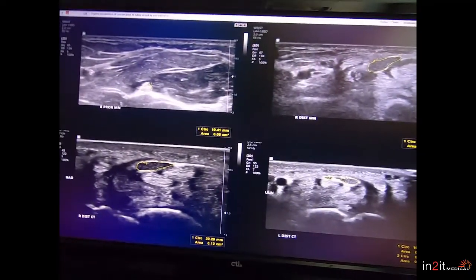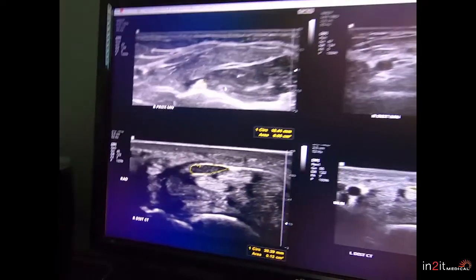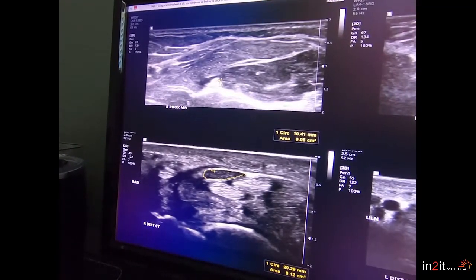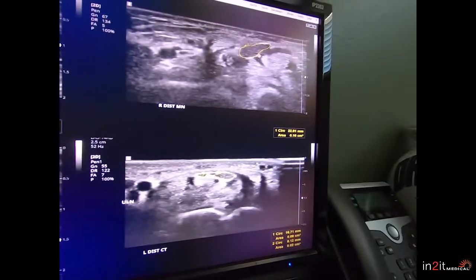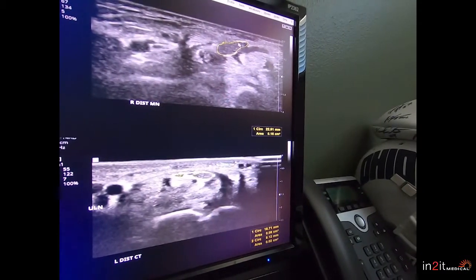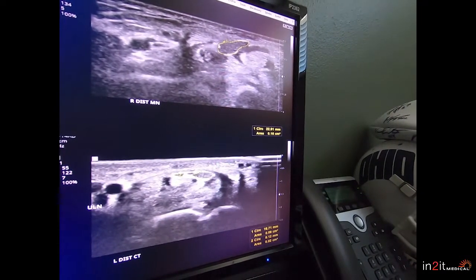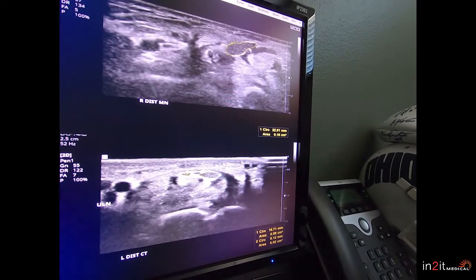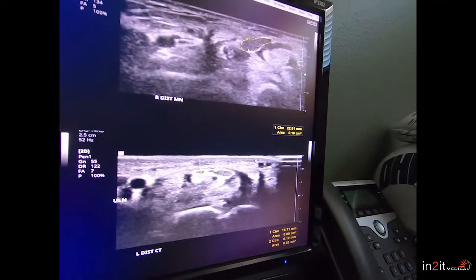Here's another case. This proximal nerve measures 5 millimeters squared — super normal in the forearm. We go distally down toward the wrist, and it's 22 millimeters squared. This thing's huge. So we can see that this is, once again, run-of-the-mill carpal tunnel syndrome.